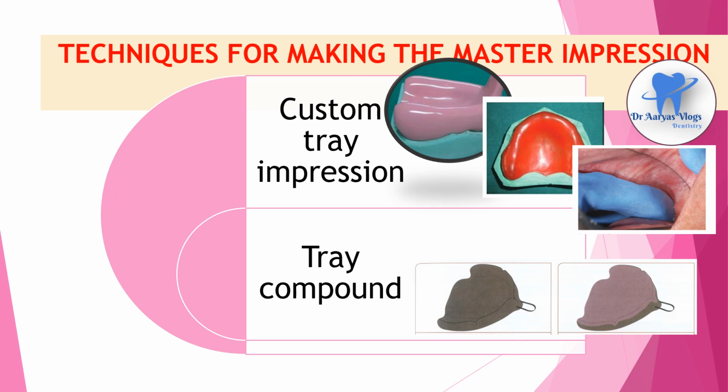And the spacer is scraped off before making the impression, and the area where the relief wax is present, the pressureless impression is recorded. And where there was no relief wax, then the tissues are recorded under pressure. And this concept of applying pressure on certain areas and relieving the others is called selective pressure impression making.